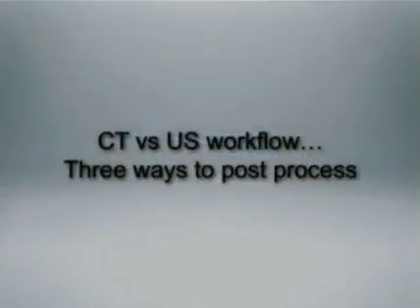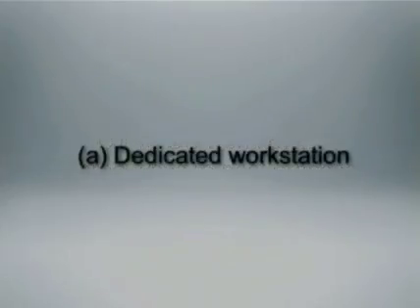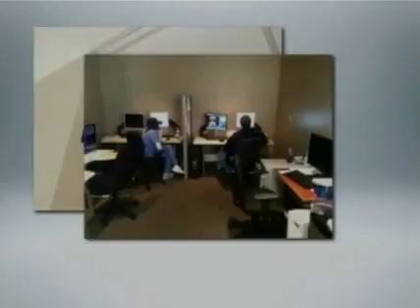It's again instructive to look at the effects of this technology comparing CT versus ultrasound in workflow as it regards post-processing. The first way to do it is using a fully dedicated workstation. We recognized that several years ago at UAB and set up a dedicated 3D lab, which is located in our outpatient clinic, and that's staffed by technologists who spend their entire day reconstructing images, mostly from CT, some from MR.